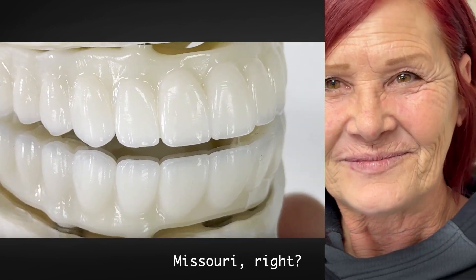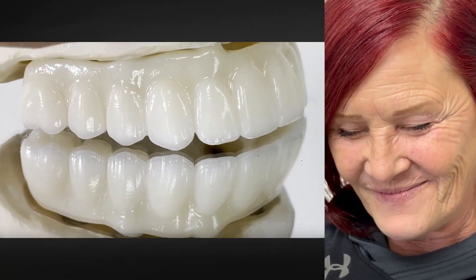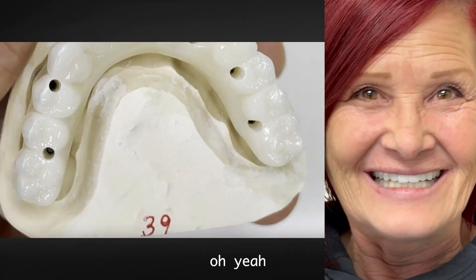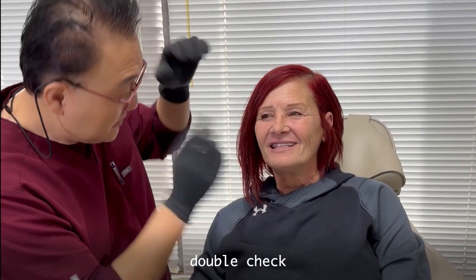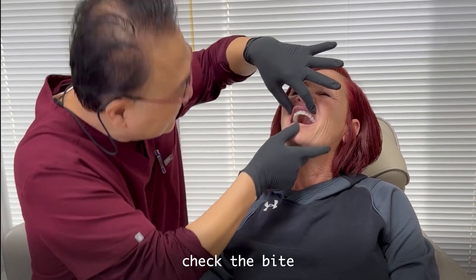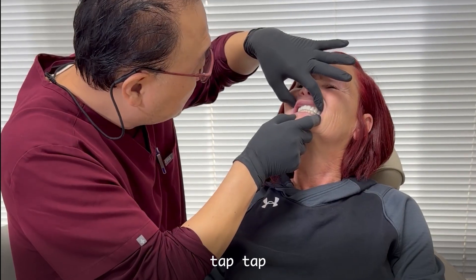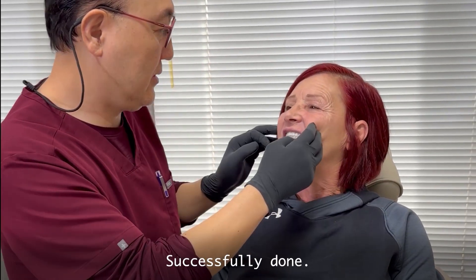Thank you — long journey, finally we finish it. That's what she wants, girly looking. And then she will go to the lower. Beautiful, thanks for coming all the way from Missouri. Appreciate it. Now you can eat — everything's good. Let me double check. Keep the bite. It's good occlusion contact — tap, tap. Great.